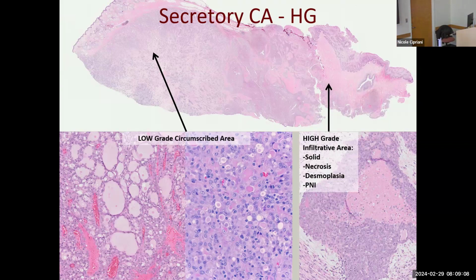ER stuff. Yeah, and these are ER/PR negative. So I honestly don't know the ER/PR status of the juvenile secretory breast cancer. If someone can find that out, that'd be great. But I do know that all salivary carcinomas should uniformly be ER/PR negative or extremely, extremely weak and non-specific. If you see any ER or PR significant expression in a salivary tumor, think about a metastasis.